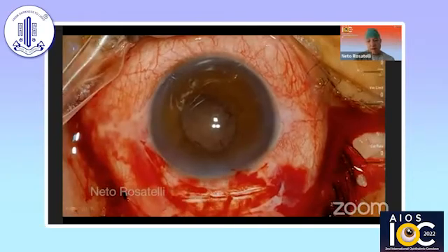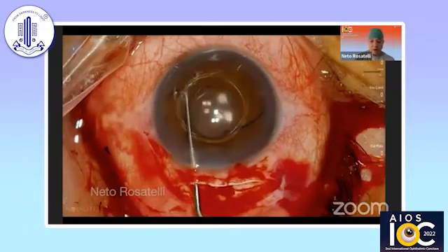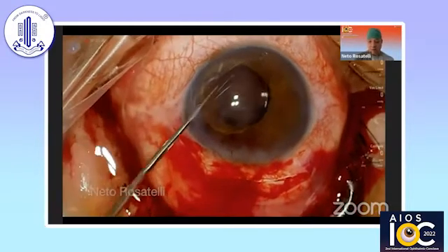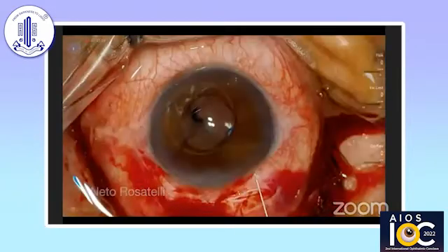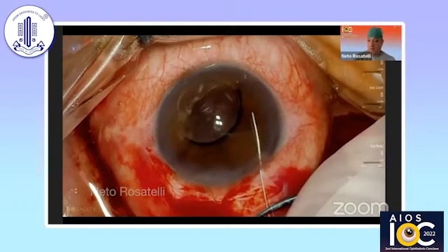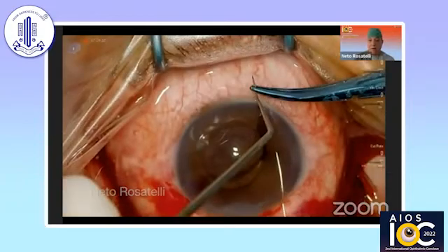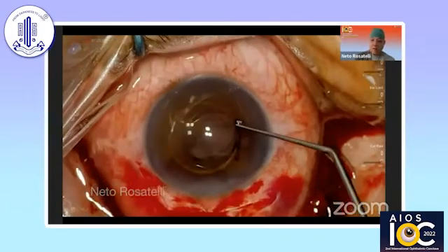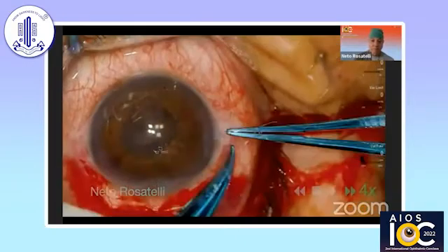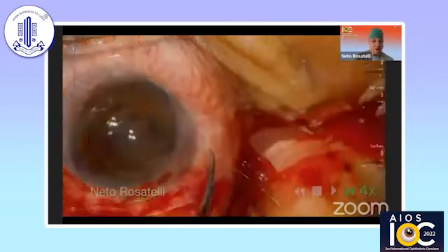Then a three-piece IOL is implanted. In this case, I suture the tunnel to allow for a more stable anterior chamber. The first haptic is sulcus-placed in preparation for its suturing. A 10-0 prolene needle is passed through the iris, catching the IOL haptic under it. The suture is completely passed, and then suture ends are retrieved from the side port. The suture ends are then tied, and the first haptic is already fixated to the iris.